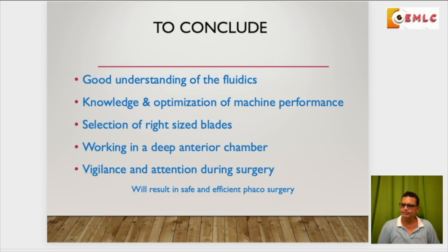so that there is not much capsular contraction in the postoperative period. So, to conclude for today, a very good understanding of the fluidics is of utmost importance to do a good phacosurgery. Knowledge and optimization of the machine performance is again very important. You should know your machine, you should know how to control the parameters of the machine. It's like driving a car. If you know your car properly, you can drive it properly.